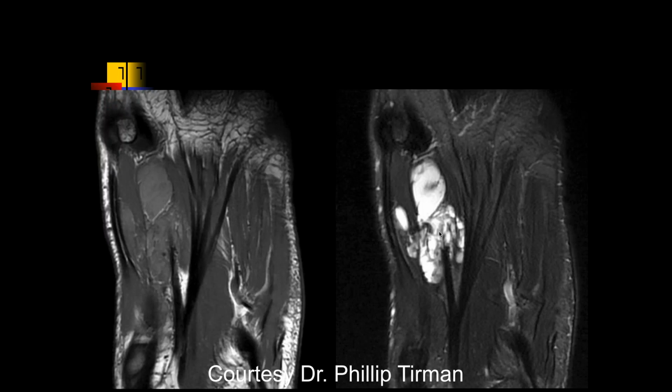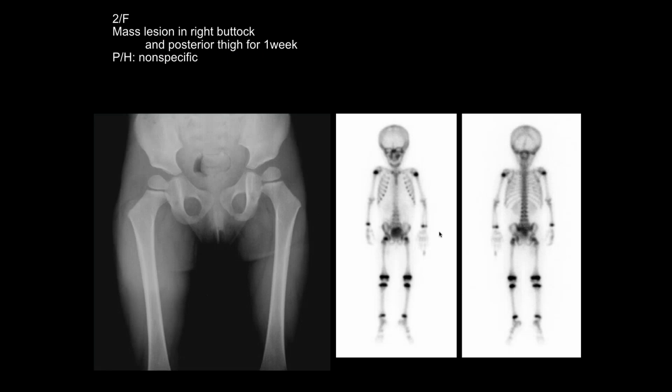Muscles, right. So again, one of those vascular malformations, hemangioma. Technically this would be a low flow malformation, probably a venous malformation. A venous lymphatic malformation is more characteristic of the fluid levels that we saw in this case. This would be very typical of a venous type malformation, because you have blood in it. Lymphatic tend to have large areas of fluid, but I don't believe they typically have fluid levels because you're not really dealing with blood. You're dealing with lymphatic tissue.